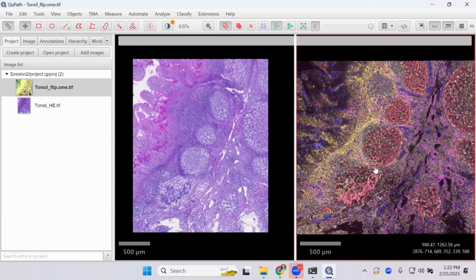Make sure to close that script before you do any of this. Apparently, it's locking some of the settings in and trying to read some of the fluorescence settings, even if you have everything set up correctly otherwise. So make sure to double click on that little floating control and close it. And when in doubt, just restart QuPath.